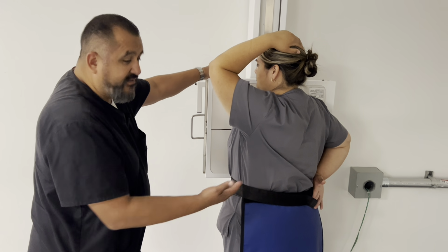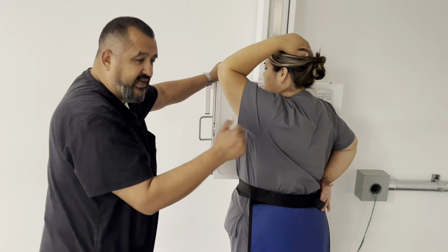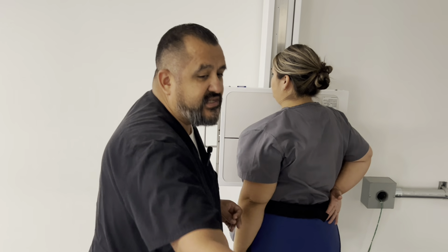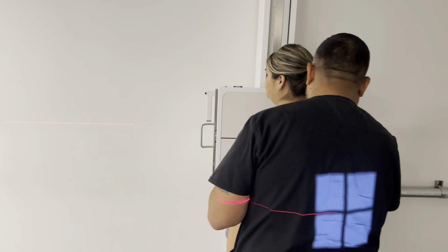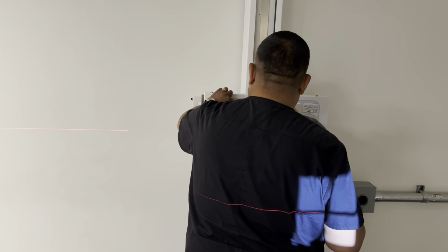Now, have the patient breathe in, breathe out, all right? Go ahead and breathe in again and hold it. Second inspiration, you go ahead and breathe and relax. Put your arm down. Now we're going to transition into an LAO position. You can relax. All right. I guess I could have left my markers there, huh? All right. There we go.